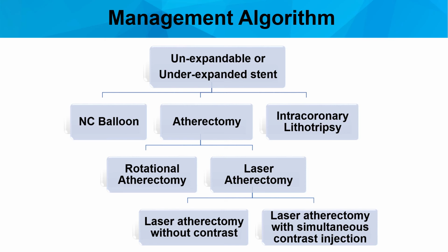If performing simultaneous contrast injection with the laser atherectomy, we recommend using a small 0.9 mm laser catheter to minimize the risk for coronary dissection.